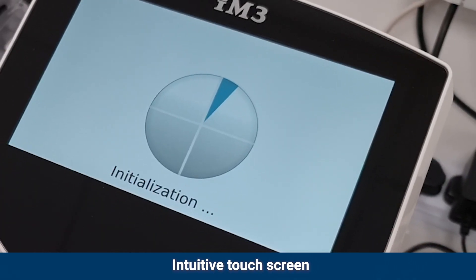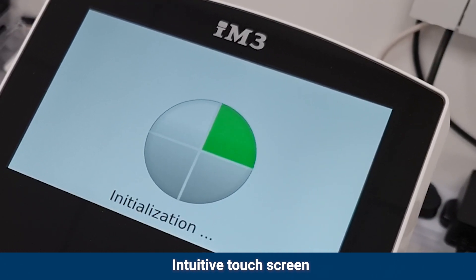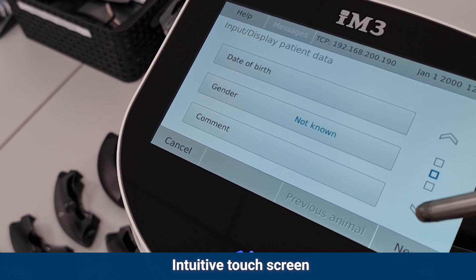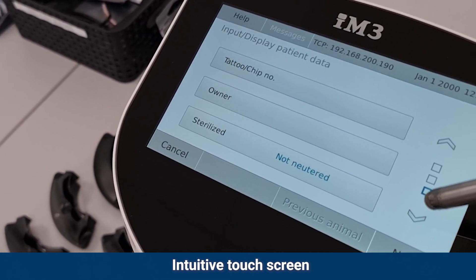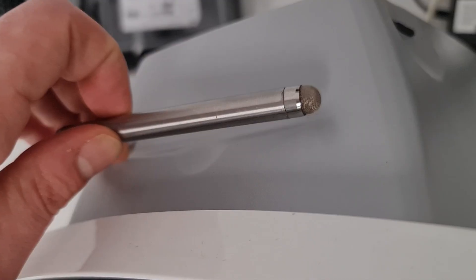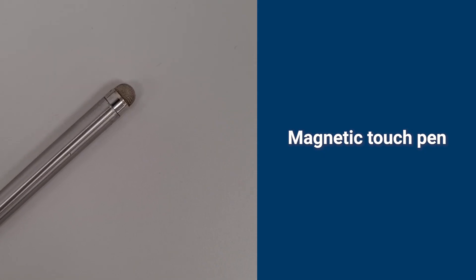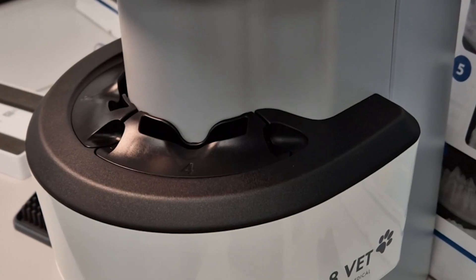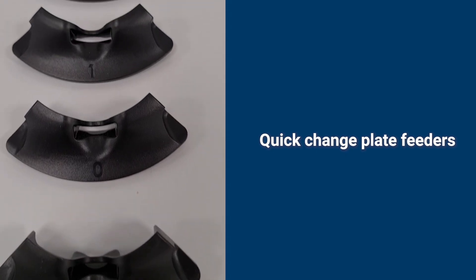Features include an intuitive touch screen, a magnetic touch pen, and quick-change plate feeders.